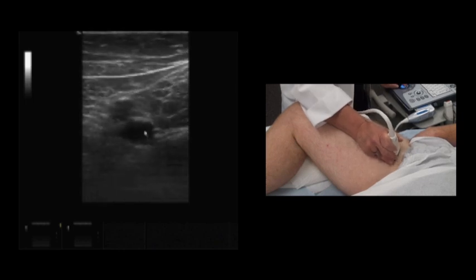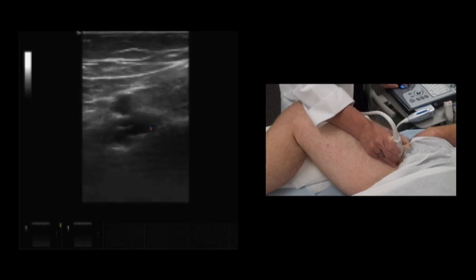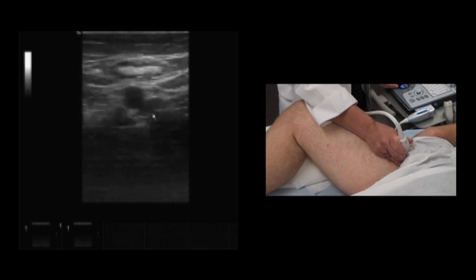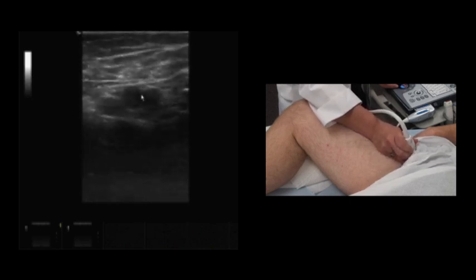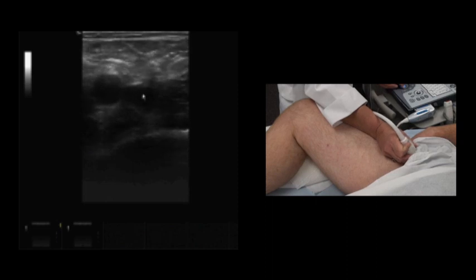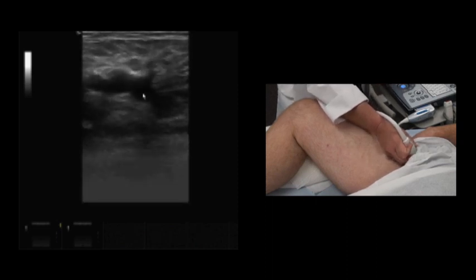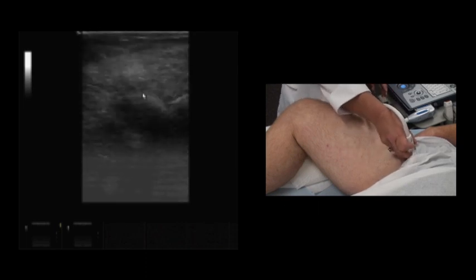And again, we want to completely compress. We see the profunda vein empty into now the superficial femoral vein. Scanning superiorly, noting that lymph node. Profunda artery, now emptying into the common femoral artery. And we'll now move to the popliteal fossa.